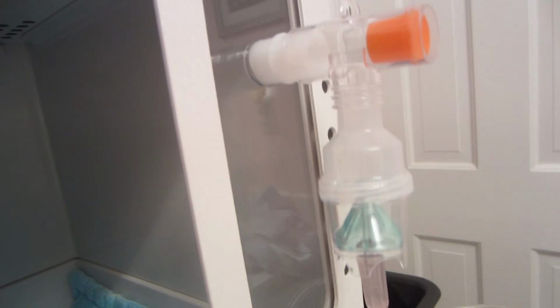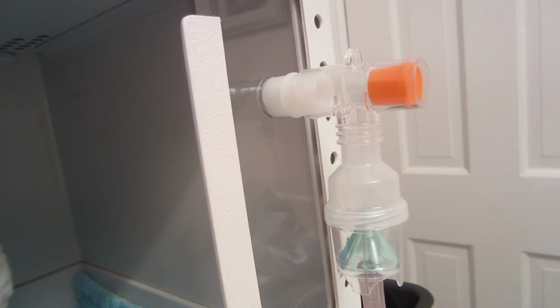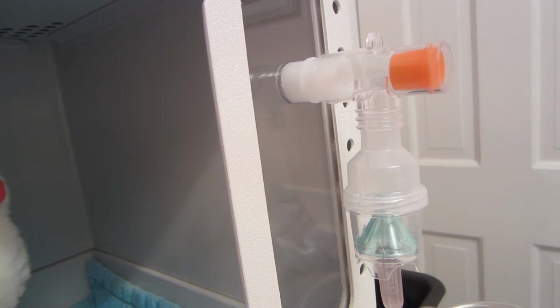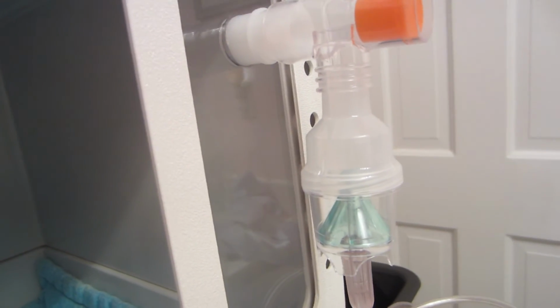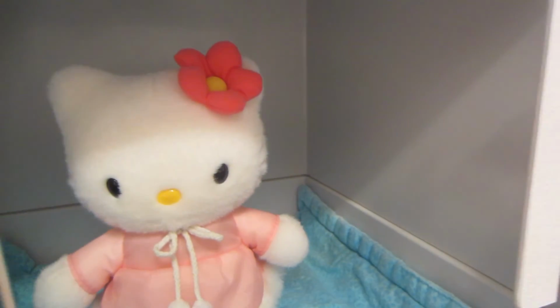The other thing I've noticed is that after the nebulizing process, sometimes the cats will have a little bit of a sticky film to their fur, and the inside of the chamber needs to be wiped out sometimes. And that's fine. Just take a damp paper towel, if you're using a carrier or a storage box, and wipe that out. You need to leave your cat in the nebulizing chamber for a full 30 minutes.